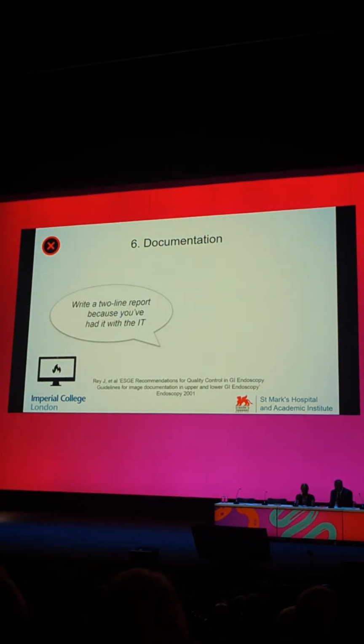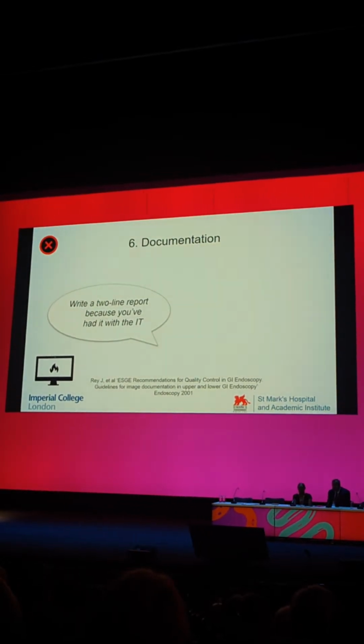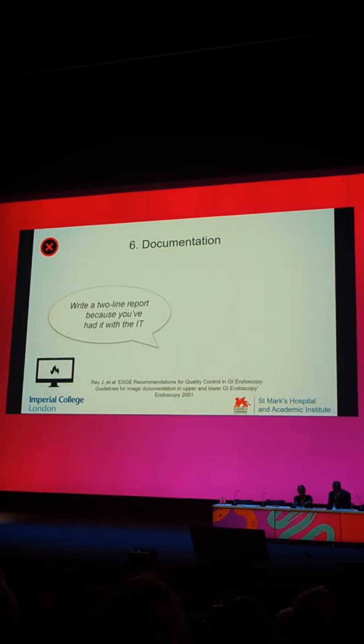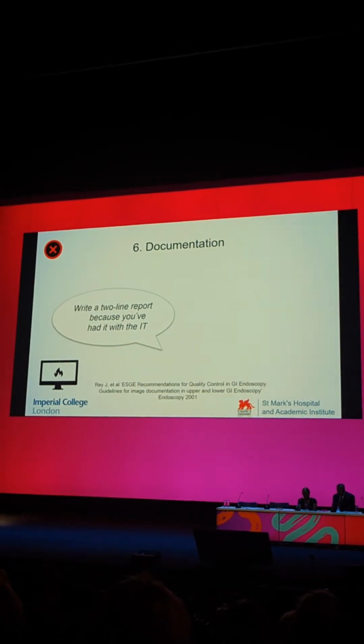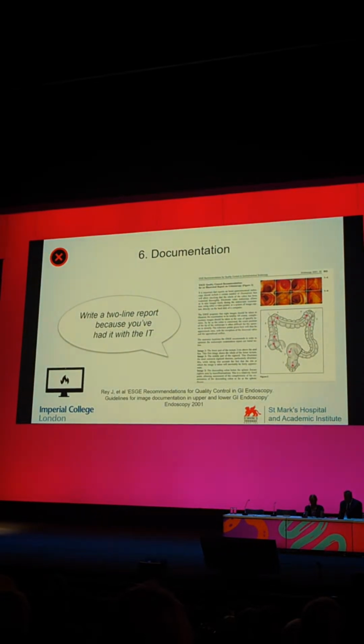So the last mistake I'm going to talk about relates to documentation. After all of that time you spent doing a briefing, doing a challenging intubation, detecting a large polyp, and then dealing with the complication, you're absolutely exhausted, but then you've got to deal with the electronic patient record. Now, we all know that there's good evidence for photo documentation.